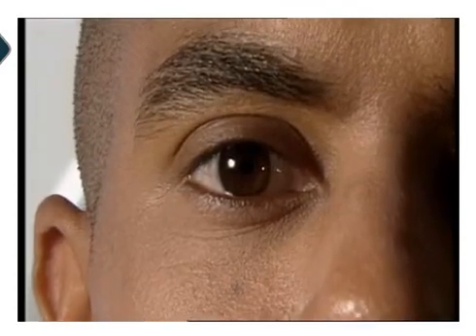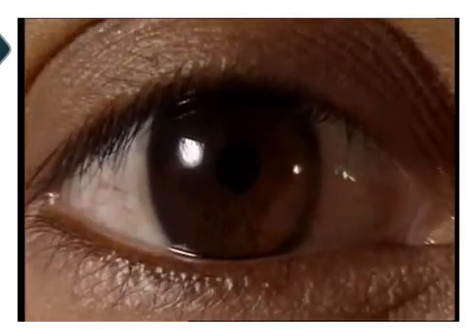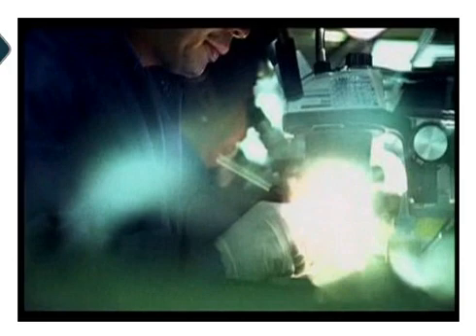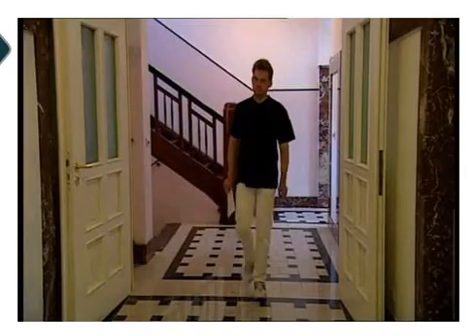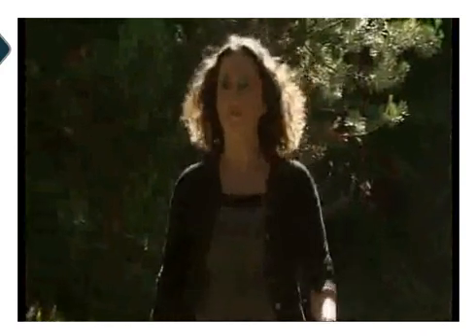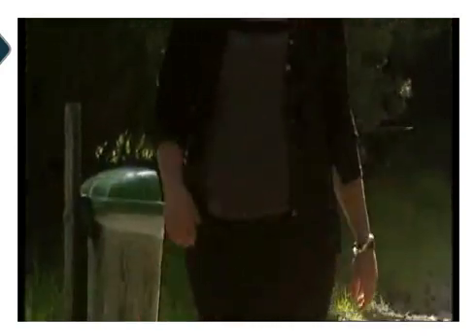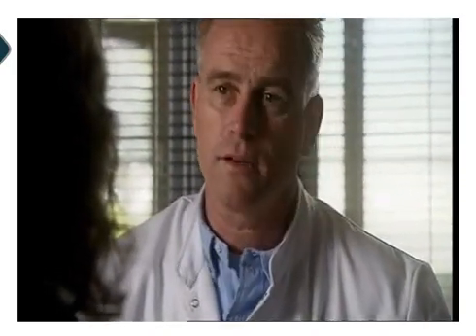There is also a risk in scanning patients who may have embedded metal fragments in or near the eye. Machine tool operators, metal workers, and welders should be given an X-ray examination to detect the presence of any metal particles. Pregnant patients can be scanned when absolutely necessary. This is a matter of clinical judgment. If pregnant patients are scanned, they are scanned at magnetic fields of 1.5 Tesla or below, at reduced SAR levels, and not during the first 3 months of pregnancy.